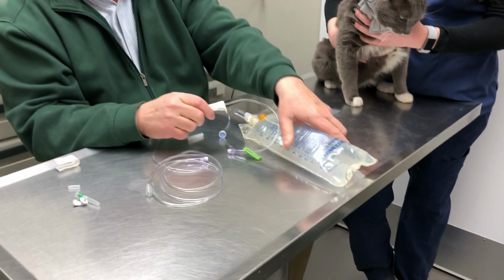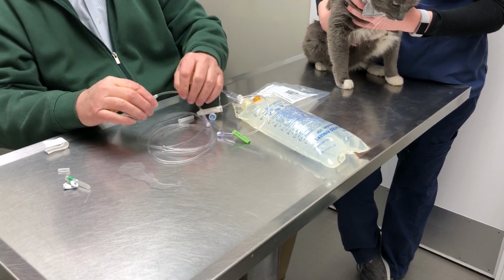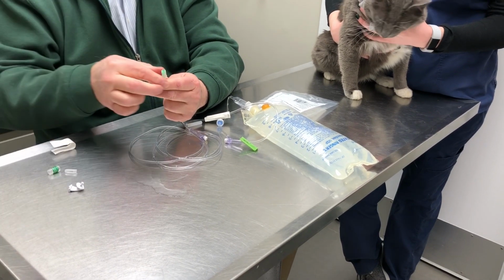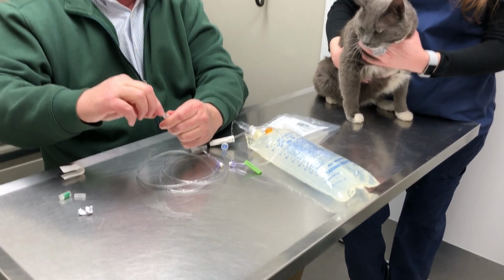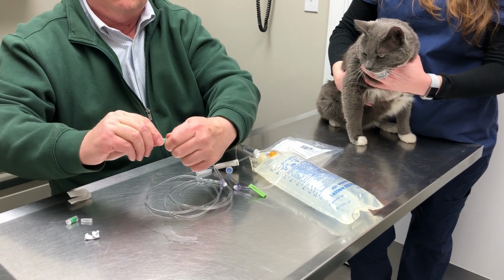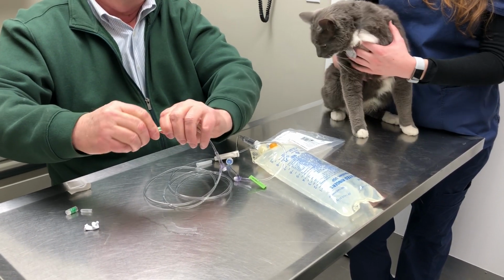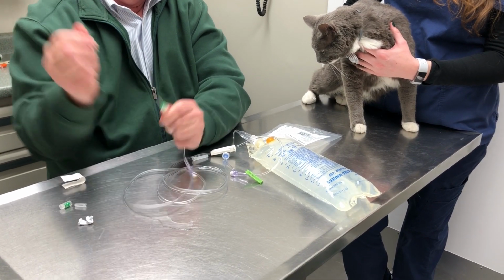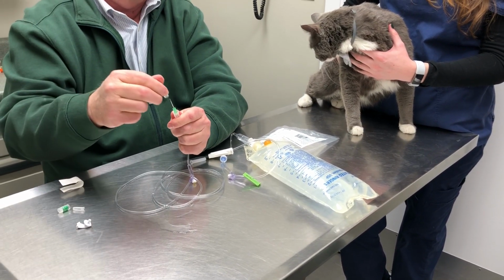So now that we've got this all loaded and we've got the line full of fluids, we're going to take, this is an 18 gauge needle. We're just going to simply undo it, put it on there. This is going to screw on, and screw off easily. And then we're going to just take that off when we're ready to give it to Manny.